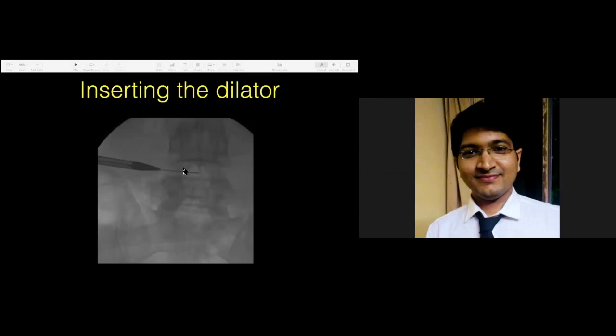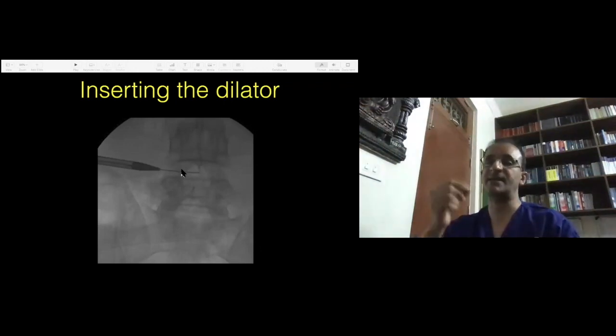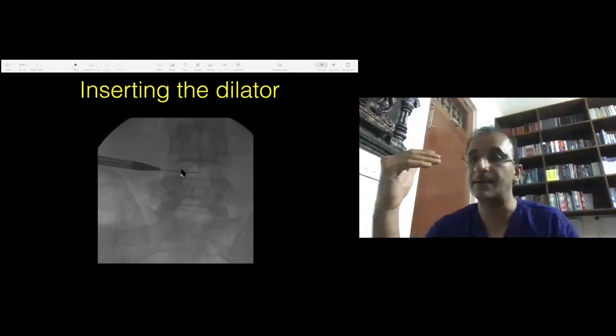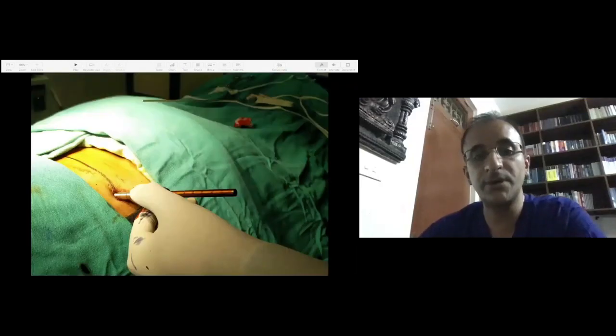The reason why you need this is, basically, we try to keep it here, but with a little bit of movement the K wire can come out. So you will have to sort of do the procedure again. Yes, sir. Okay. Any more questions?